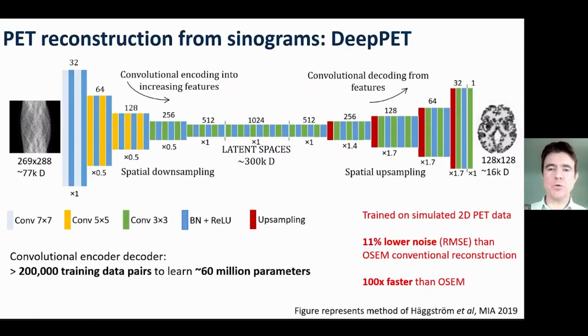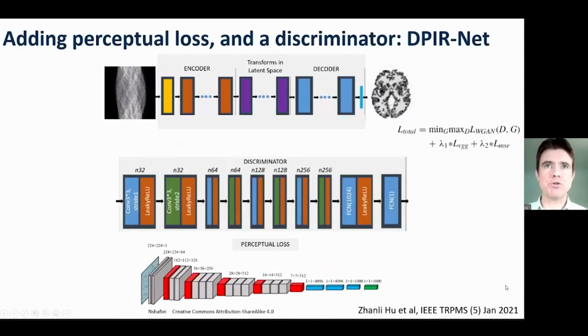And they show, of course, some kind of benefit. They're showing reduced noise in the reconstruction, and of course a direct mapping can give you an inference far, far more quickly than a conventional iterative reconstruction method. Okay, we've got to press on to make sure I get through the content in my limited time.